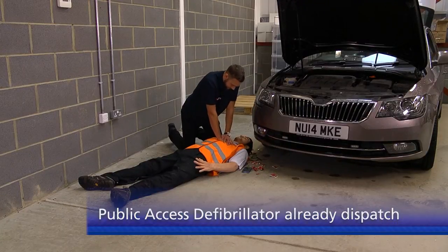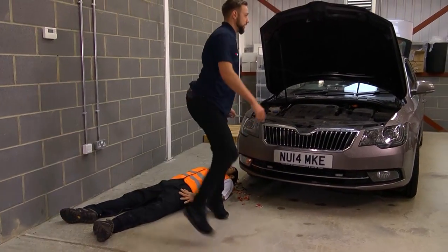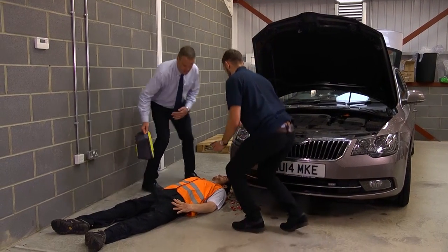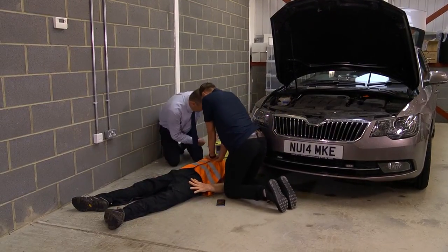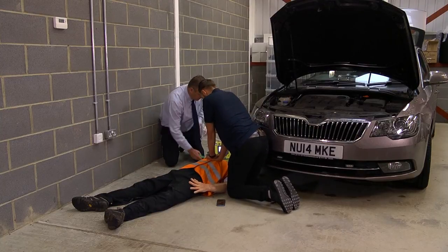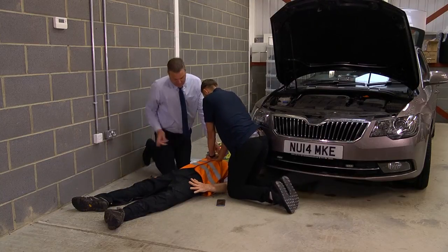Hello? Oh, someone's here, hello? Hello, where are you? He's here. Hi, I'm Jamie from the office around the corner. Hi, what's happening? I'm Nathan, this is Greg. I've just heard a bang and I found him unconscious. Do you want to carry on doing CPR? Yeah. Is that a first responder, yeah? He is, yeah. I'm going to get the AED on, okay? You just keep doing what you're doing. Okay. Keep going. Yep.